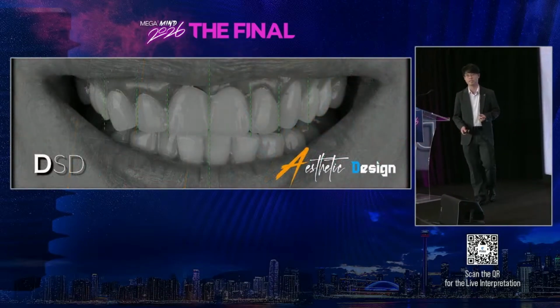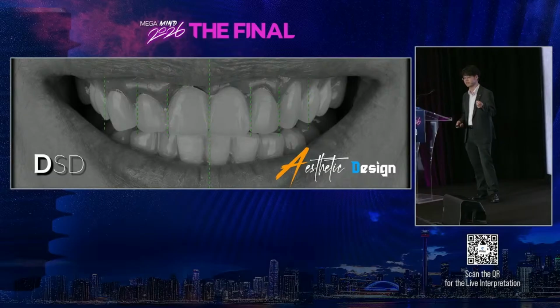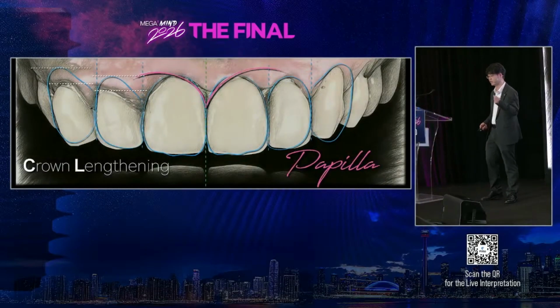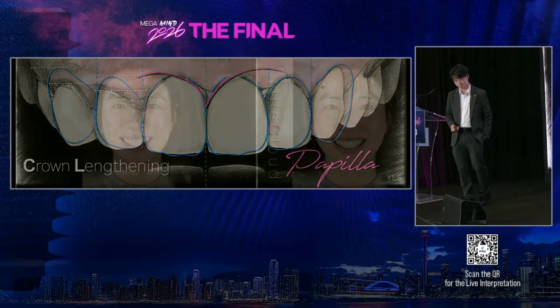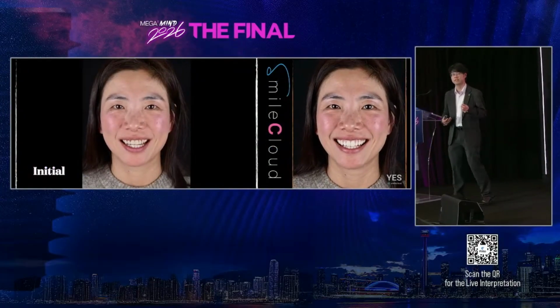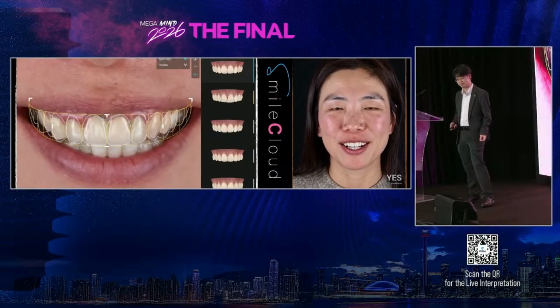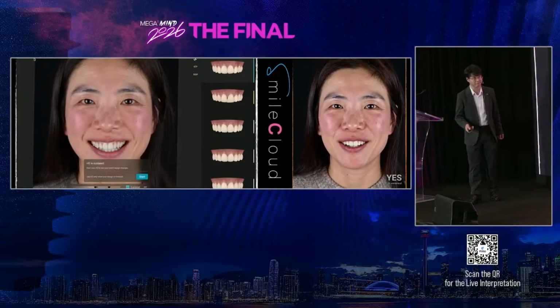So we need to consider the smile line, the tooth proportion, the incisal profile. So we did a detailed smile design for the patient. On the right side, we need crown lengthening, and also need to manage the papilla. So we use the Smile Cloud software to design the virtual smile of the patient: the tooth proportion, the length, the smile line, incisal profile, and we can see the virtual effect after we design.